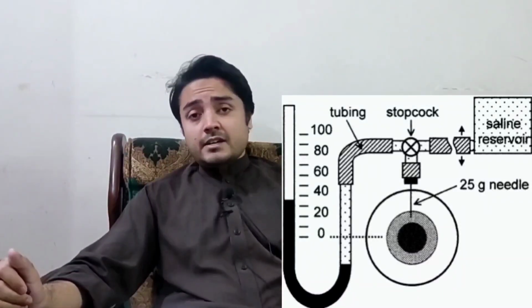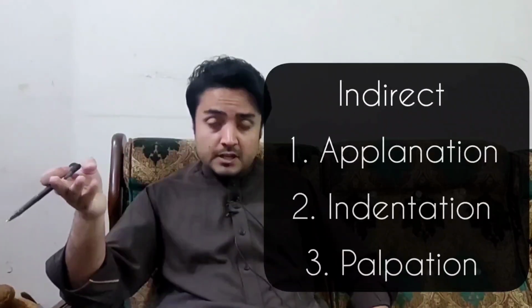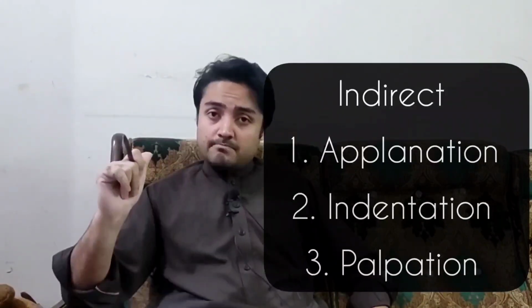An example of the direct method is manometry. You can see it in the image here. Now, in indirect, there are various methods. Let's discuss them one by one. The indirect is further divided into three parts: applanation, indentation, and palpation.